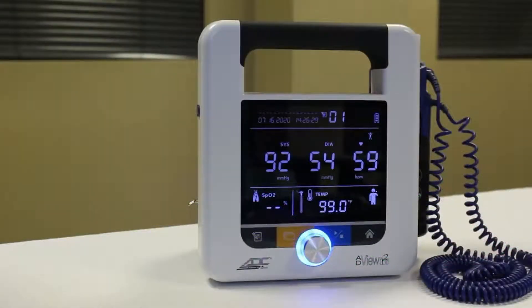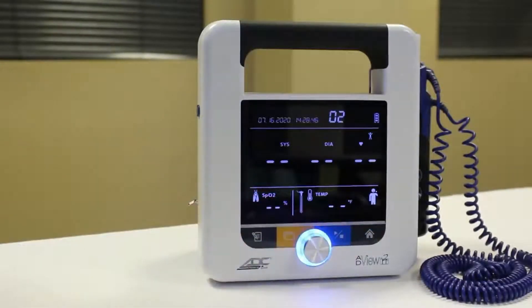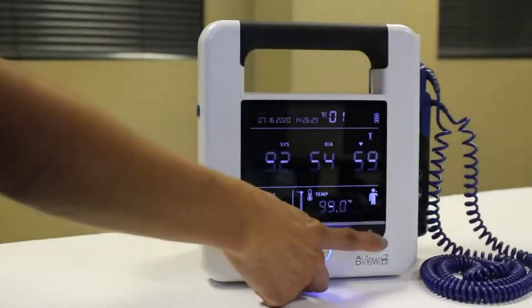Your device will default to single measurement mode each time it's powered up. You can also revert to single measurement mode by pressing the home button. Before starting, ensure any previous values are cleared from the display. Press the memory button to save an earlier reading that's still on screen, or press the home button to clear an older reading without saving it.